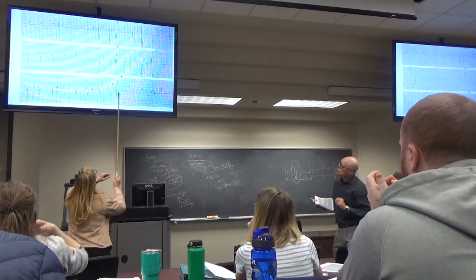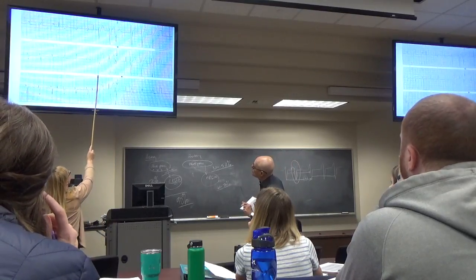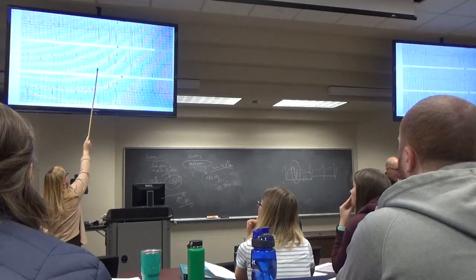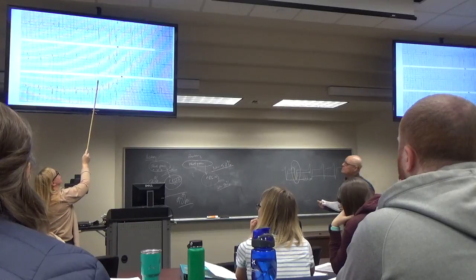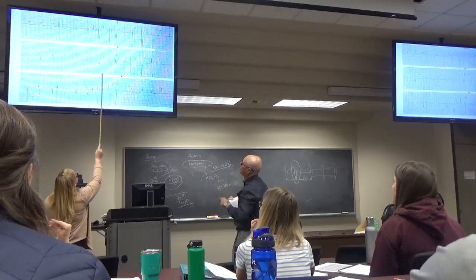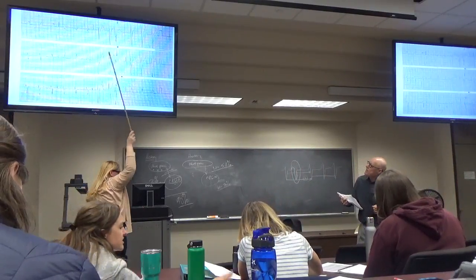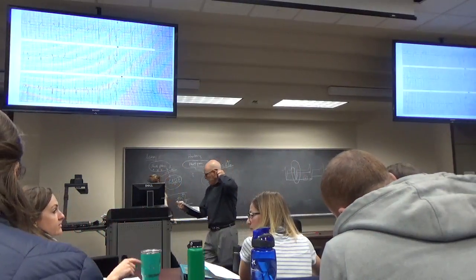So as far as LVH, when you're measuring that, this one's very obvious. Think where you've got this line that comes down, and then it essentially goes over and goes back up. That's because you've run out of paper, and this line didn't go all the way down. Even if you were to count these boxes, you've got to notice that this one actually goes further. This one here. And that's in V2, so if you add those to the R wave in V5, you got LVH 3 points. It does the same thing here. It's not as obvious. It does the same thing up there. Good observation. Number 14.